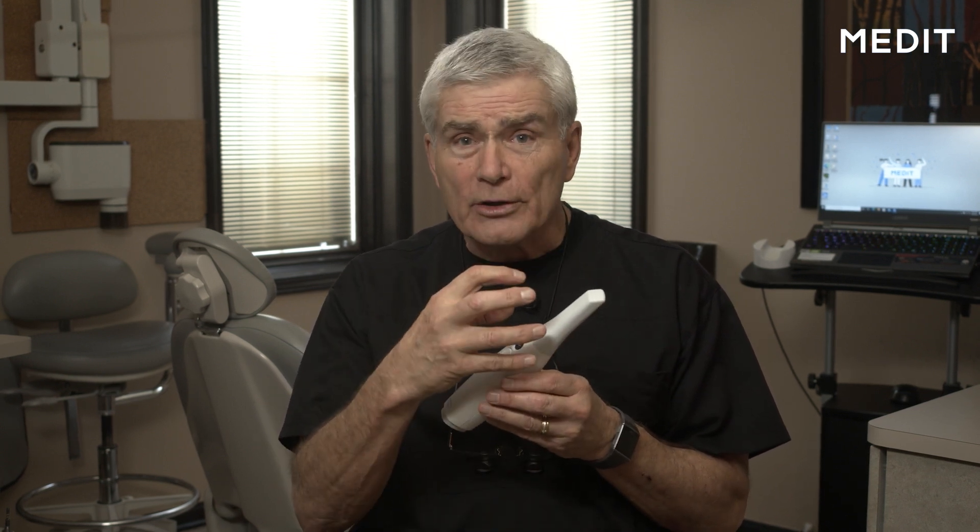I wanted to talk just a little bit about the features, advantages and benefits of the new i700 handpiece for the scanner. First off, it's lighter. Second, it's smaller, and yet the aperture down here has a little bit wider opening that allows you to pick up more of the surface area, so you get a little bit of the buccal and the lingual at the same time.